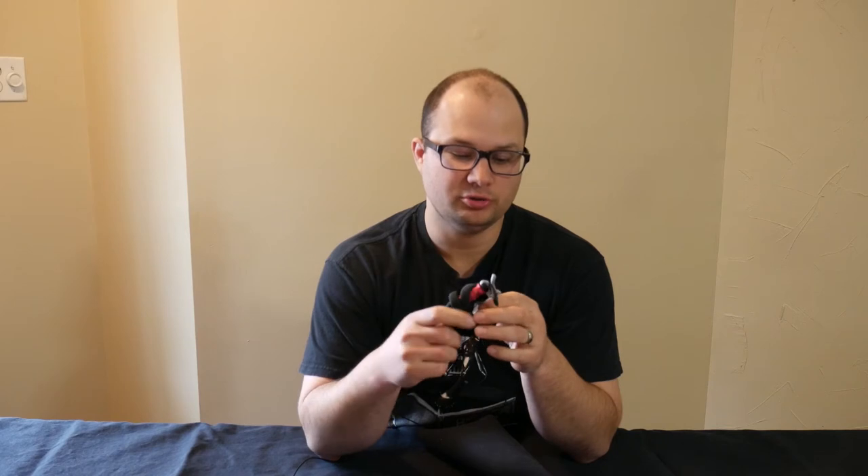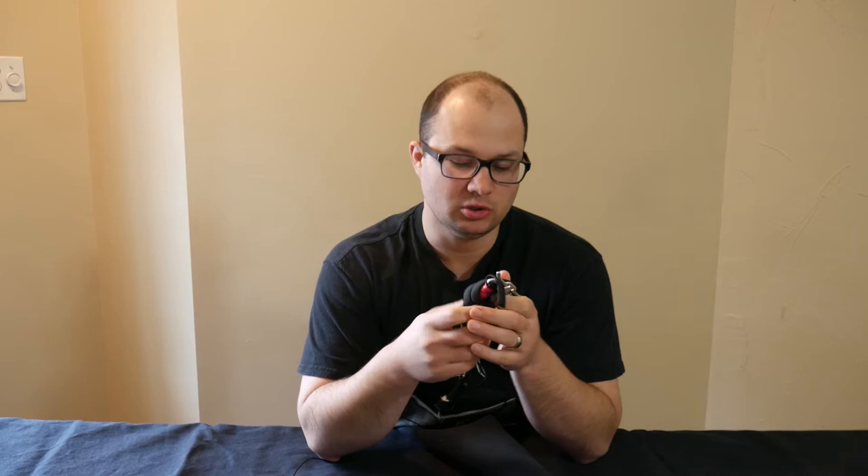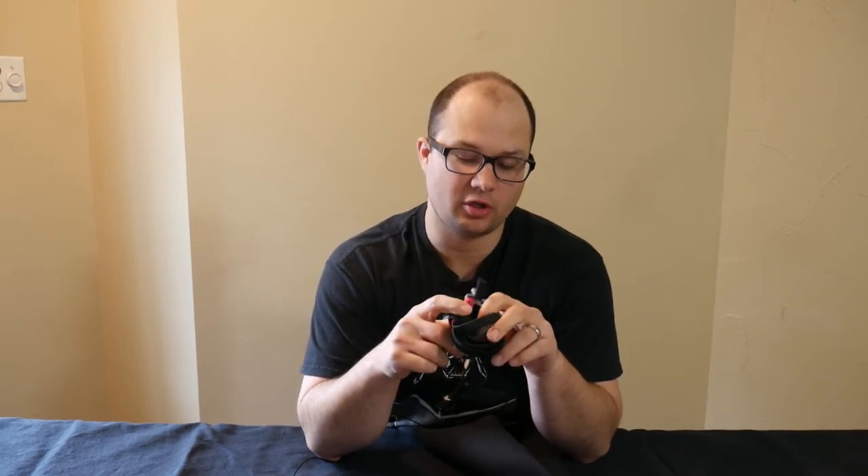I got a RAT's tourniquet a couple years ago because at that time it was the only tourniquet I knew of that could fit on a child. You can also use them on pets — that was one of the big selling points. It was much more versatile than a standard CAT or SOF-T Wide tourniquet. I saw several people on YouTube that I respect who recommended it, so I bought two of them. I made my wife carry one in her purse for a long time in case she ever needed one for our kids.